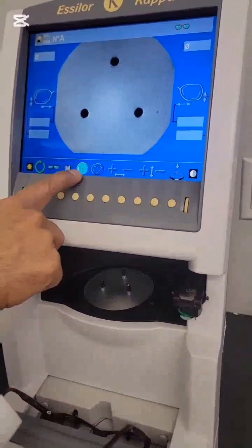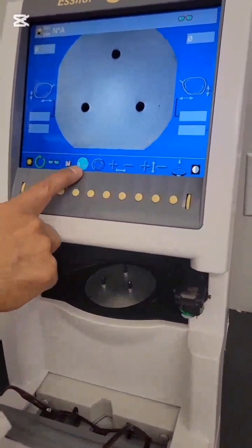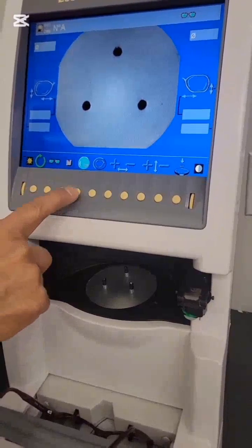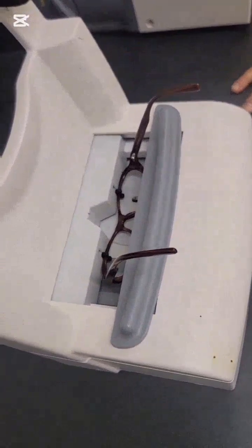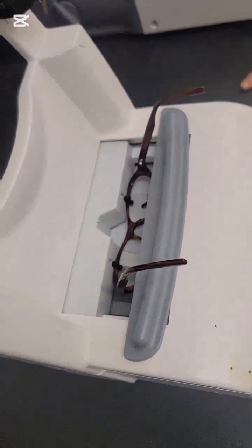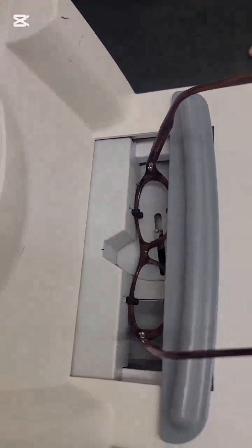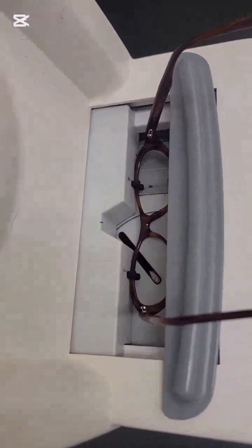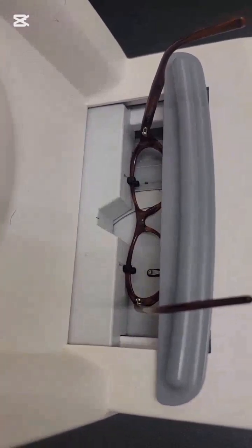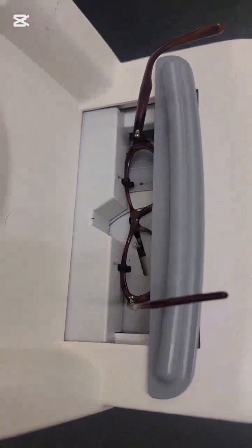You may use this button to navigate between single vision lens, flat top bifocal, progressive, and executive lens. Press the green arrow button to start tracing. As soon as you press the button, the small pin inside the tracer will begin tracing from right lens and then will move to left lens. It will trace inside of the frame. It usually takes few seconds to complete the tracing. Proper positioning of frame is necessary to ensure the recording of correct measurement.